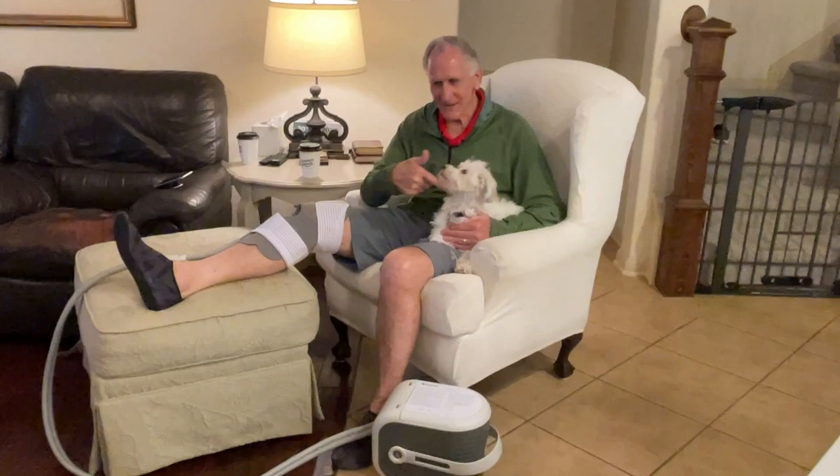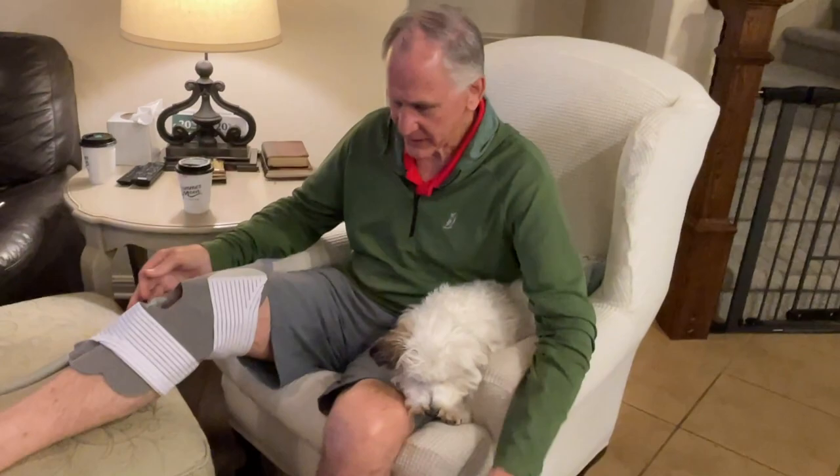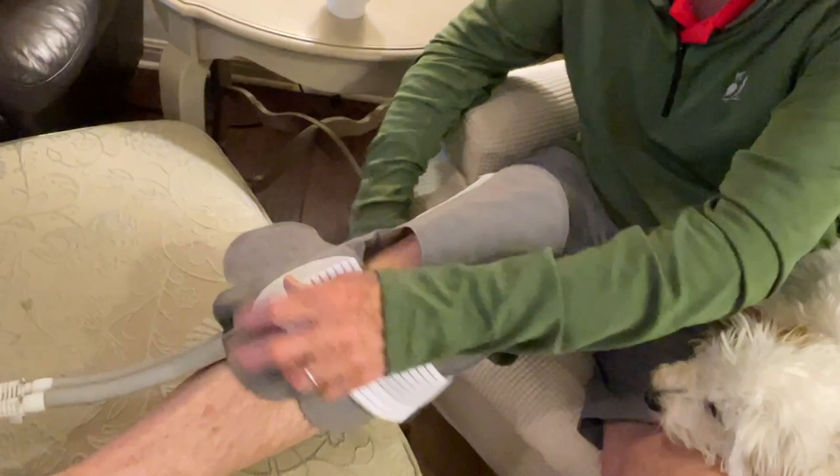Why is no one talking about this on the internet? Not this, but on the total knee replacement — the ice machine. This ice machine was the number one tool I used. Thinking back, it's been a year and a half since I had this surgery.